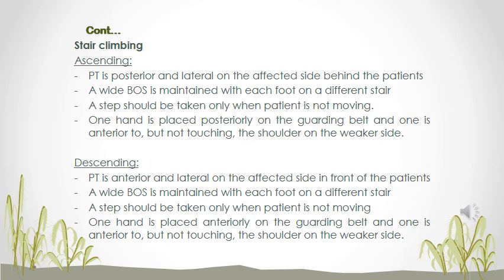Prior to discharge, teach your patient how to ascend and descend stairs or even a step. It will give them security and confidence to know that when they go home, they will be able to safely and successfully climb stairs. So a few considerations before we come to how you will teach them specifics.